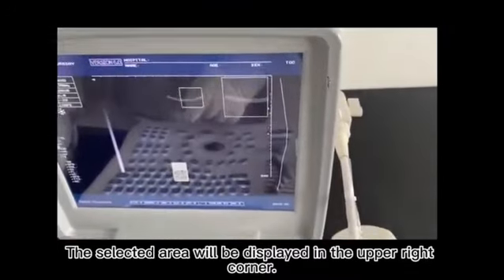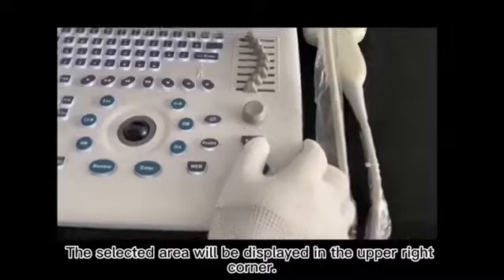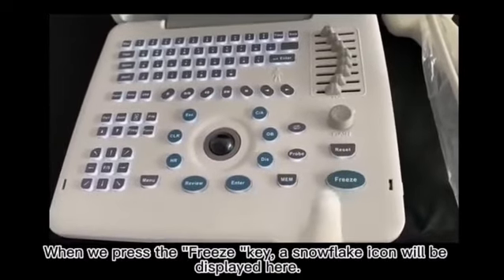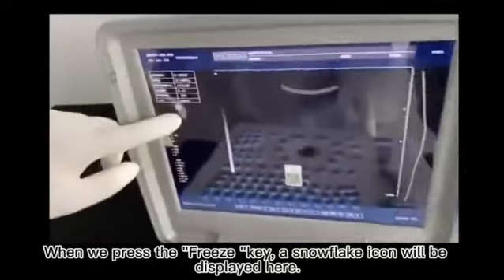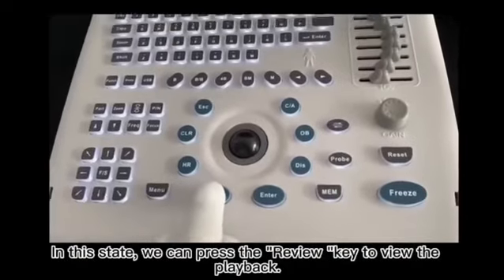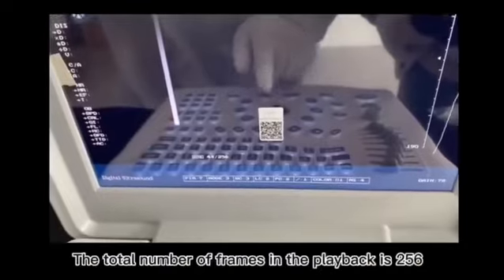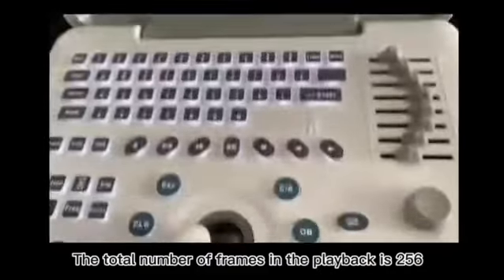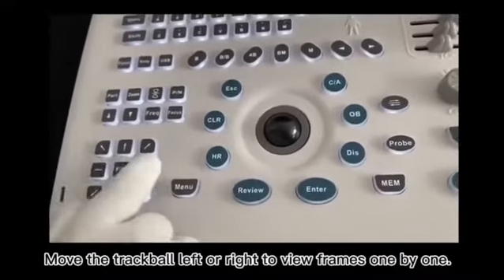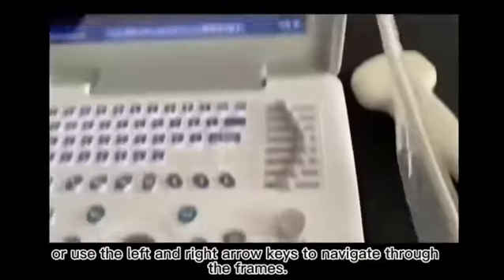The selected area will be displayed in the upper right corner. Next, let us talk about the freezing function. When we press the freeze key, a snowflake icon will be displayed here. In this state, we can press the review key to view the playback. The total number of frames in the playback is 256. Move the trackball left or right to view frames one by one, or use the left and right arrow keys to navigate through the frames.